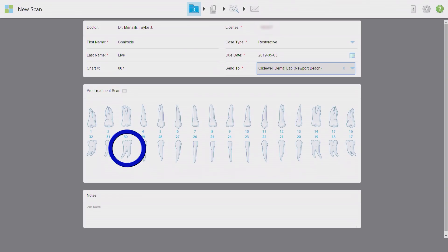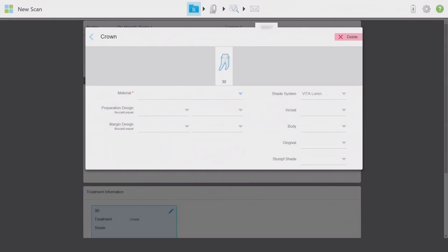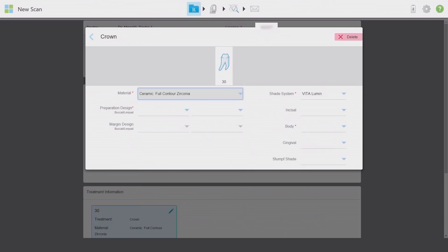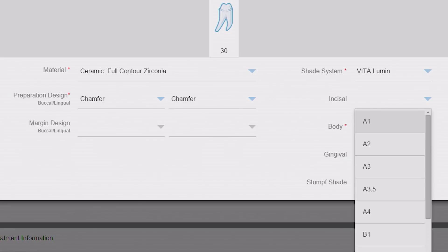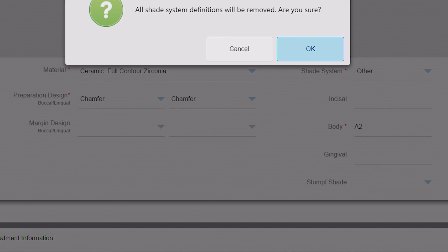I'm going to give as much information as possible in this prescription portion. I'll select the tooth in question and click on the appropriate restoration — today is a full coverage crown that has been prepared. This opens a new menu to enter more specific details about the crown. My doctor is requesting a Bruxer Aesthetic solid zirconia restoration; the full contour zirconia tab is selected. I'll specify in the notes exactly what product is needed. I'm entering chamfer preparation design and then the shade acquired from the Vita guide. If you use a different shade guide, click on the shade system and select it from the drop-down menu, or select Other and enter it manually.